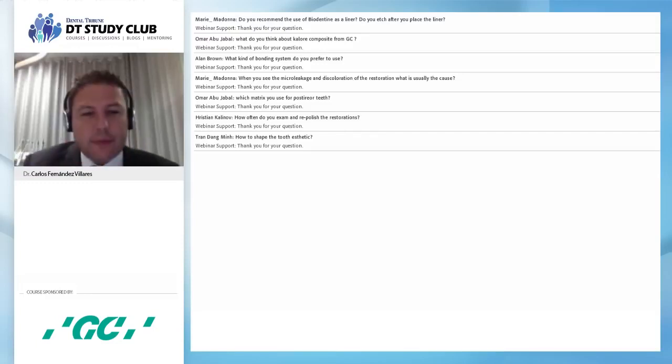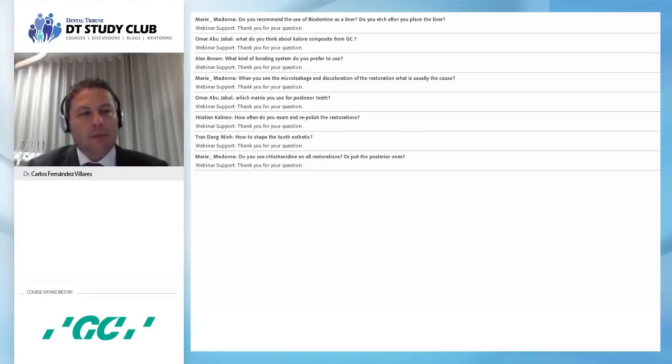Okay, Maria Madonna asked me if I use chlorhexidine in all restorations, or only in the posterior ones. Well, normally I use it in the posterior ones, but if I have an anterior restoration that has more dentin than enamel, for example, in patients with erosions, in patients that have some problem of acidic attacks that eliminate the enamel itself, in those cases I use the chlorhexidine after the etching phase.